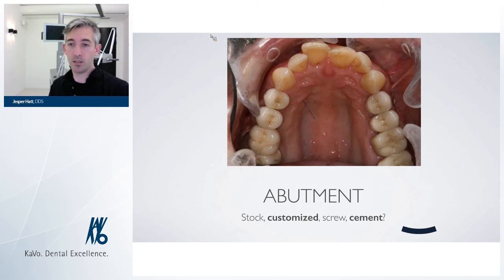I think the technician did a really great job, and so far, as I said, it holds up. It's been in the mouth for about 4 or 5 years. We actually considered doing some ortho on her anteriors, but we didn't dare to do that because of the trauma. So that's why they stay like they do.